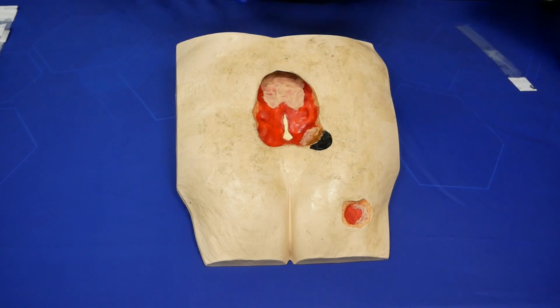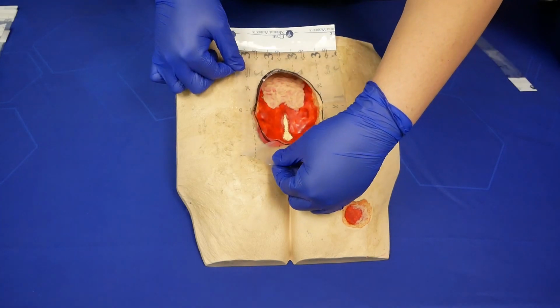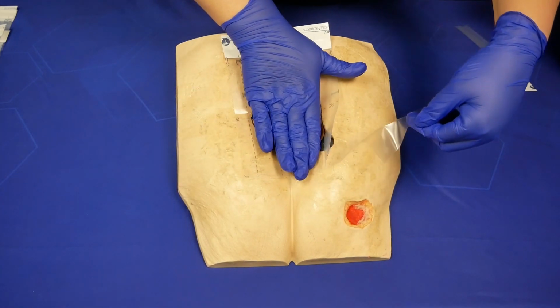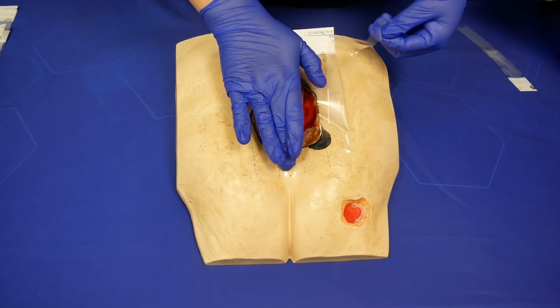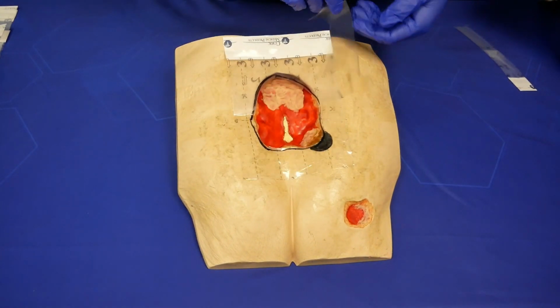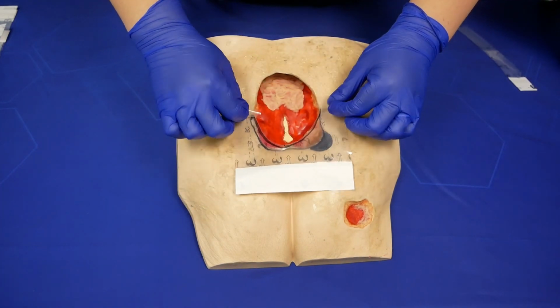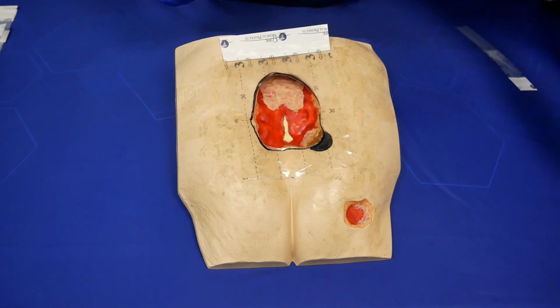So typically, when I apply on a wound like this, I will start on one end, typically whatever I could potentially have struggles with. And this particular area on a coccyx sacral area can be difficult. So we're just going to lay this down and pull this out from underneath. And that allows us then to flip this forward and apply the rest of it as such.